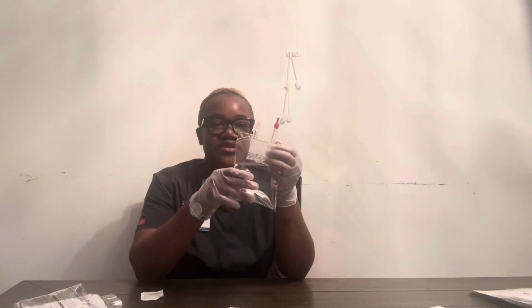I'm going to start by performing my hand hygiene, and I'm going to apply my gloves. Okay, so I have gathered my supplies. I have my primary fluid. I have verified the physician's order in the MAR. I have verified the 6 rights of med administration. I've verified that I have the right patient, the right drug, the right dose, the right time, the right route, and the right documentation.